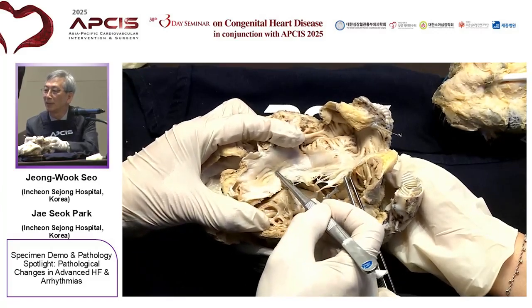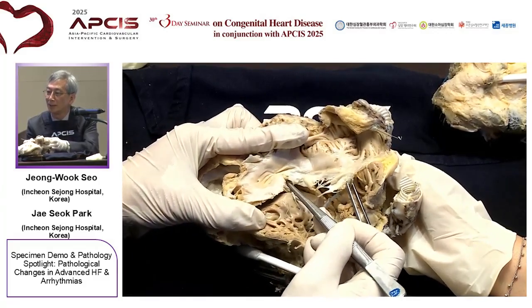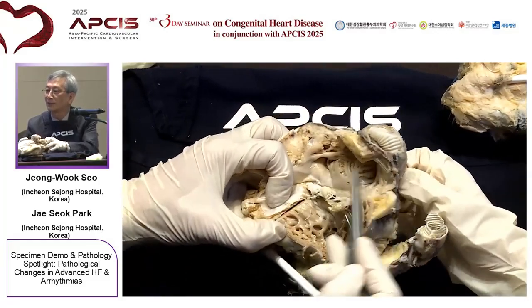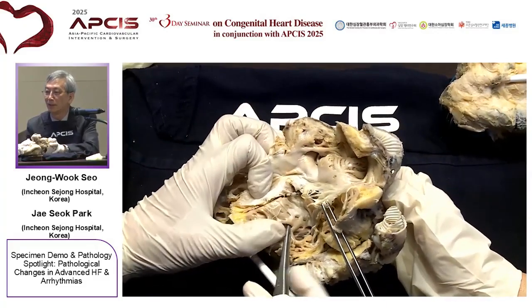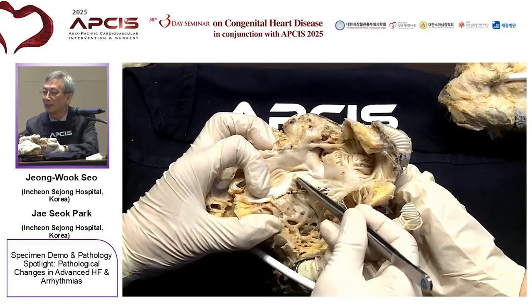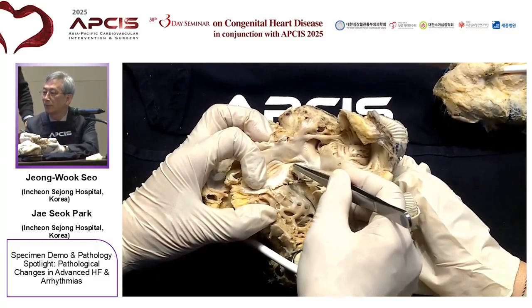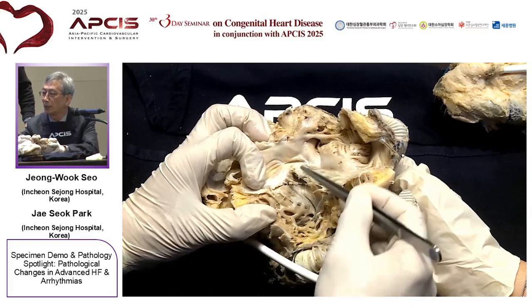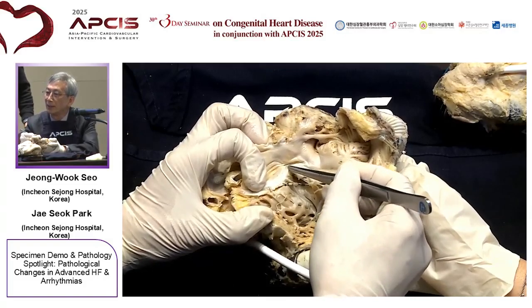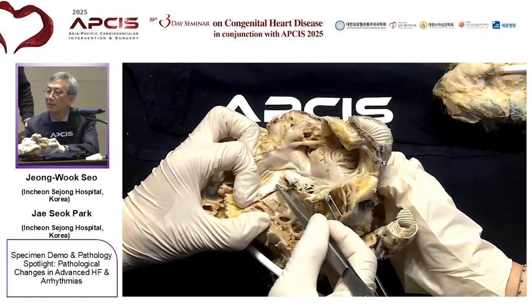So what do you think about this CSP lead placement? This part is the membranous septum, atrioventricular membranous septum. This part is the interventricular membranous septum. So I found this location of the CSP lead is perfect. That means the fold from the right side is in this way, but from the left side it goes this way. So if the conduction His bundle is there, inferiorly, this part is a very good position for the CSP lead.